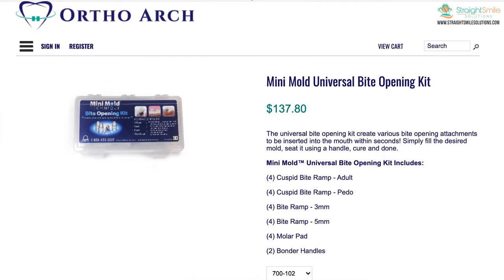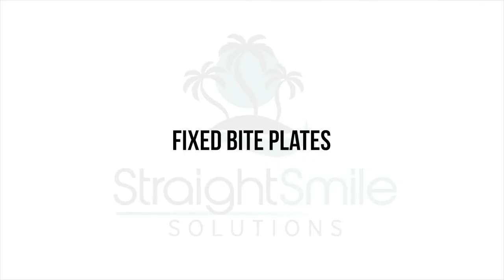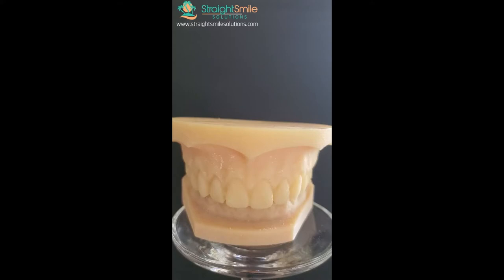Obviously if you have a huge overjet you're going to have to use a bite plate to level the curve of Spee, but these are great if you're in braces, especially if you have all your teeth in. This is my go-to solution for any patient with a deep bite — especially a growing patient with a deep bite or a phase one patient. Here you can see there's a pretty significant deep bite, and taking a ceph is nice to verify the numbers clinically.